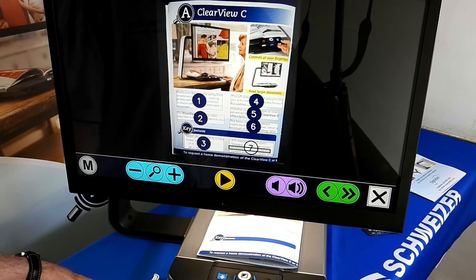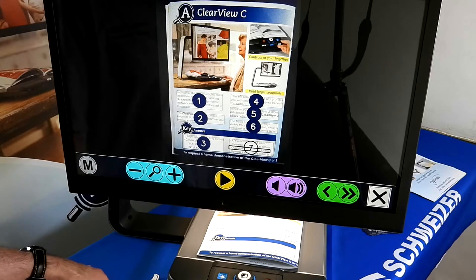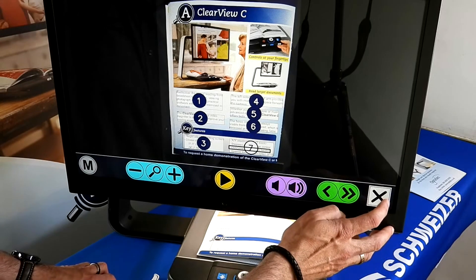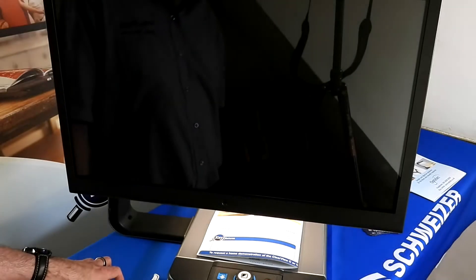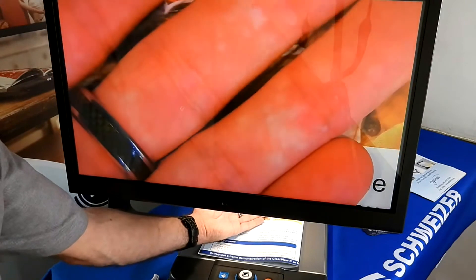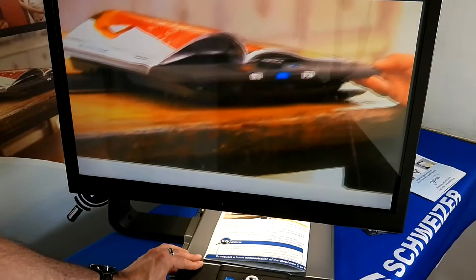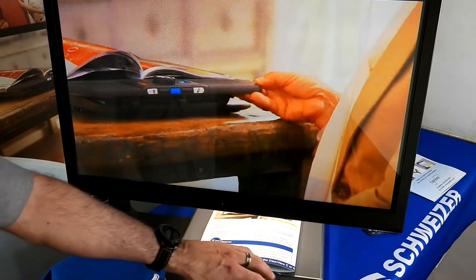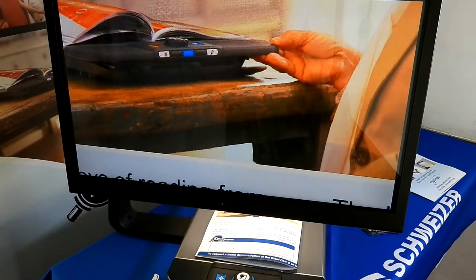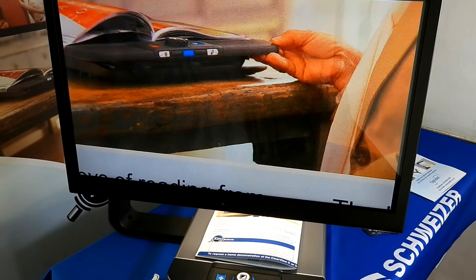That's a quick overview of the CVC Speech Plus part of our Clearview range. X brings you out, and now it's back to being a normal standard video magnifier. As usual, if you have any further questions, there's a load of information on our websites, and our team in the office would be more than happy to answer any questions on our usual free phone number. Thank you very much for your time.